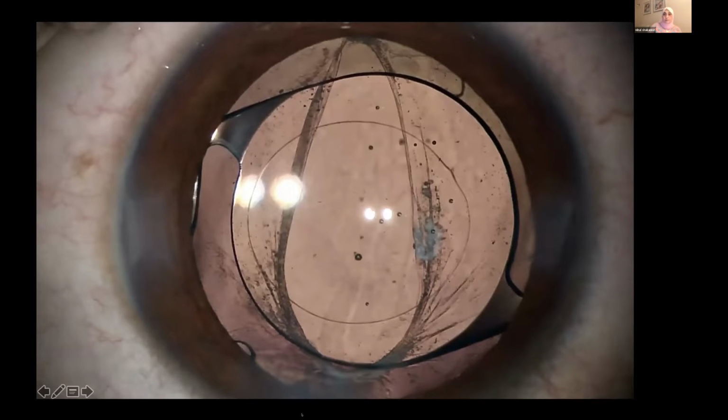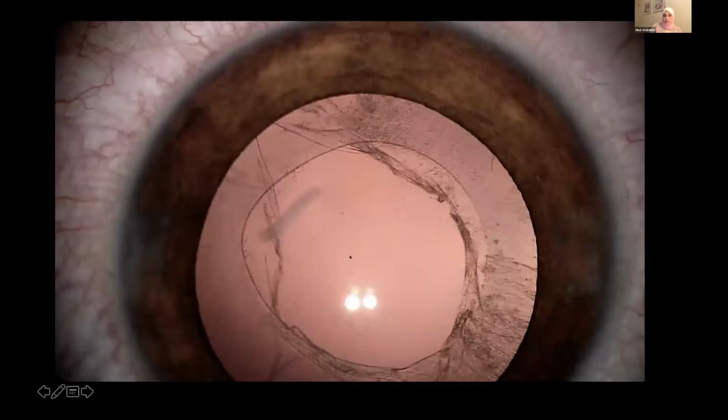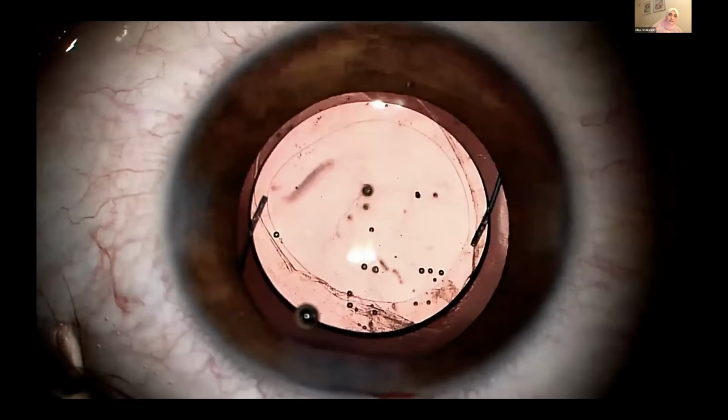But in cases with a large defect that is totally irregular and you cannot see its edge, there is no way. You have to remove the posterior capsule, implant in sulcus, and perform optic capture technique.